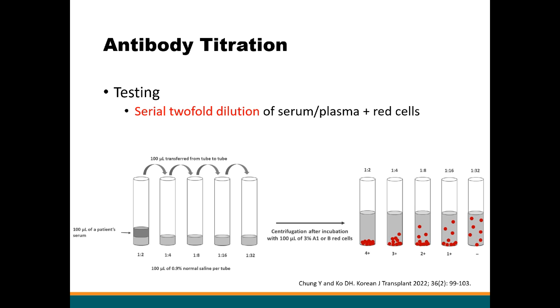However, the antibody titration test has several limitations. The test is not yet standardized, and there are significant degrees of inter-observer and inter-laboratory variation. And antibody titration is by nature semi-quantitative. Last, it does not reflect the in vivo activity of ABO antibodies.